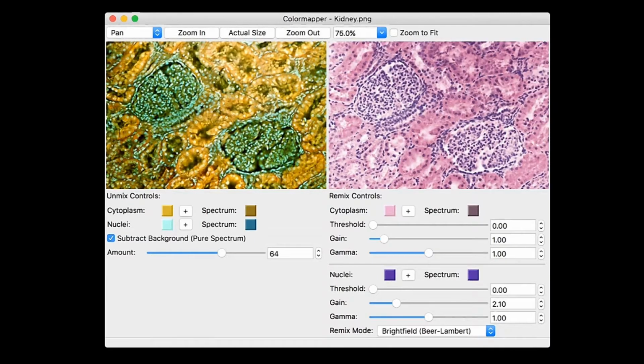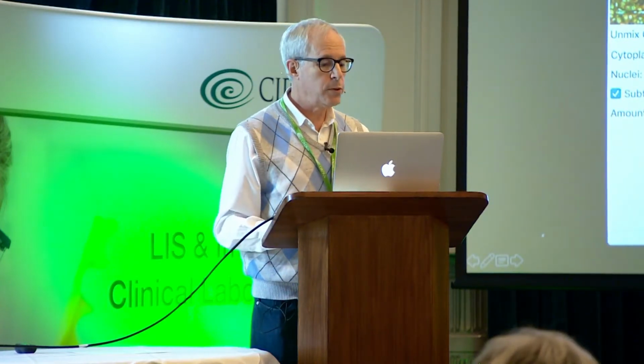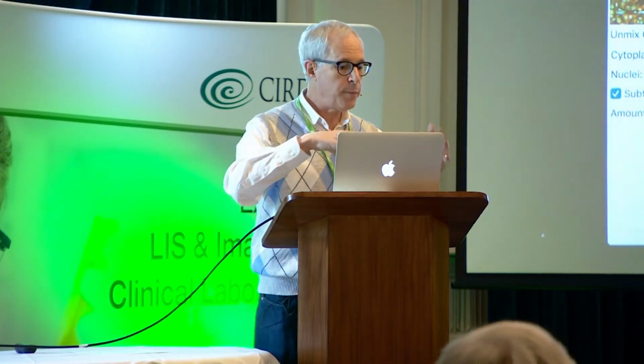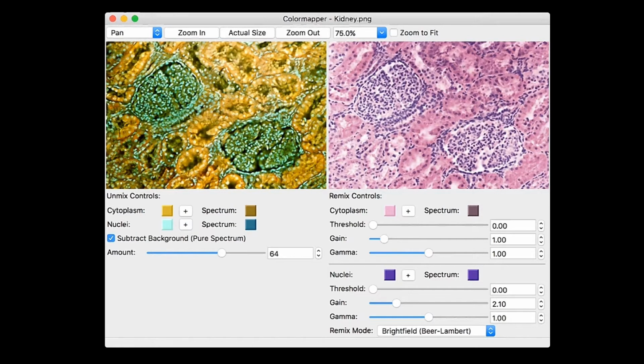Now, pathologists are boring, and they're not excited by looking at colors like this. So this is what the camera actually sees, but they insist for some reason, and I'm a pathologist, that we convert it to look like H&E, and so we have a quick tool in the software to do that. But as I'll show you at the end, it's not very good, and we've enlisted AI to do a much better job of mapping from the colors and images that we see with the MUSE stuff to convincing H&E-like appearance. But I'll show you stuff that we've done the old way first.